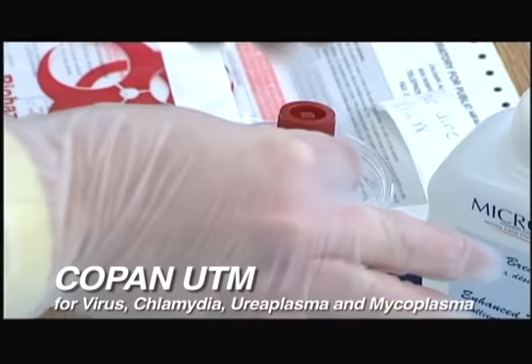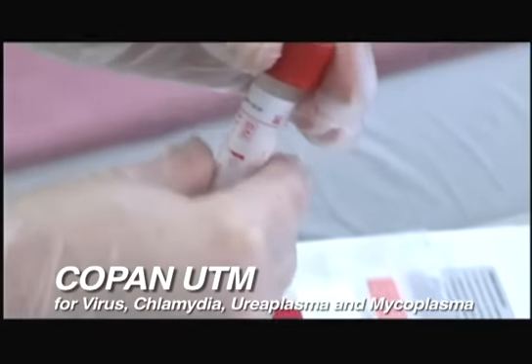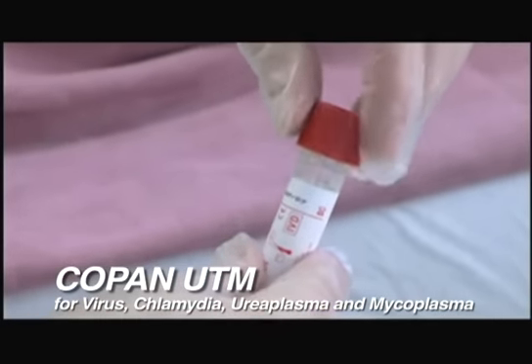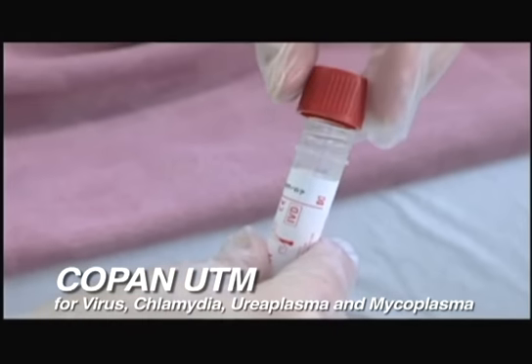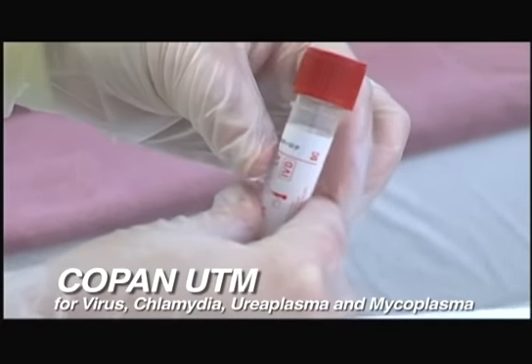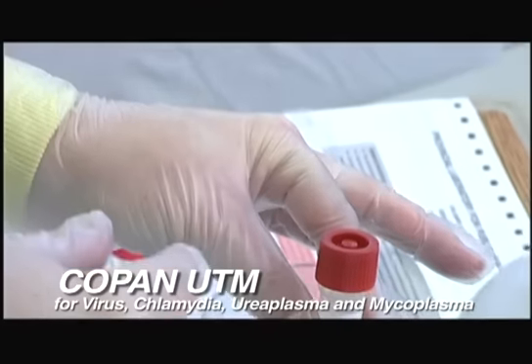This next section describes the universal transport medium for the collection of respiratory viruses. This is the universal transport medium container, which is available from our current supplier, Copan. This medium can be used for a collection of samples from a number of different respiratory and non-respiratory sources for respiratory viruses, herpes, chlamydia, ureaplasma, and mycoplasma.